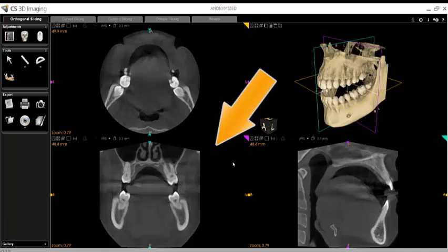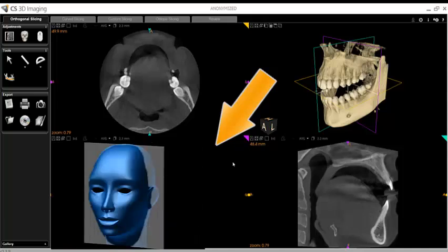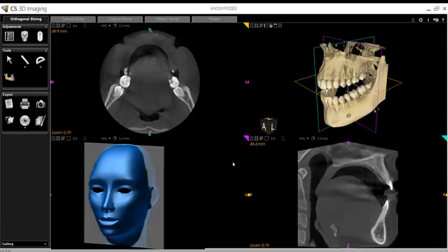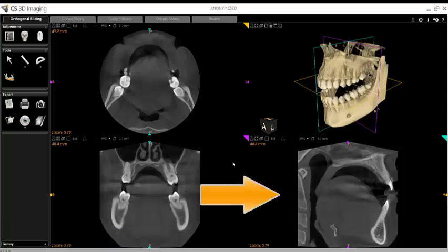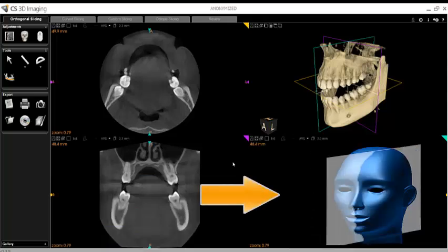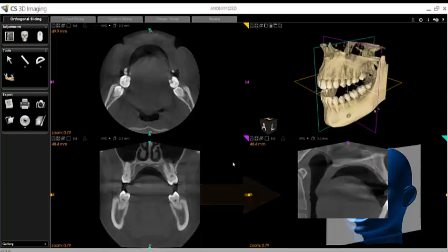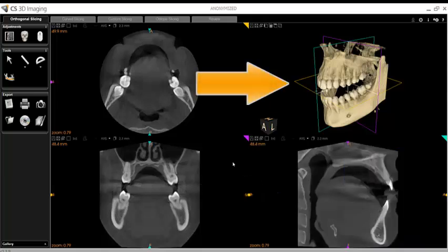In the lower left, the Coronal Orientation allows us to view back to front, front to back. In the lower right is the Sagittal View, which allows us to move right to left, left to right. And in the upper right is the three-dimensional rendering, which can be rotated in any direction with a left-click, hold, and drag.